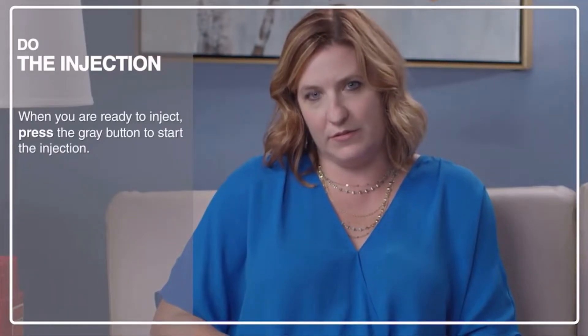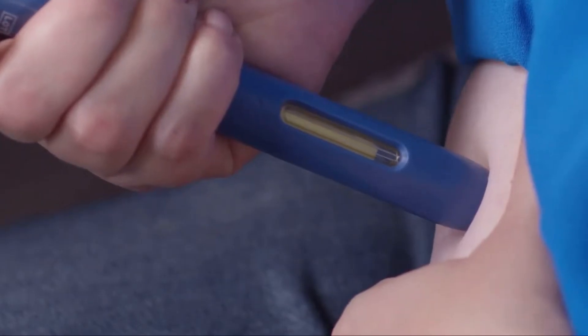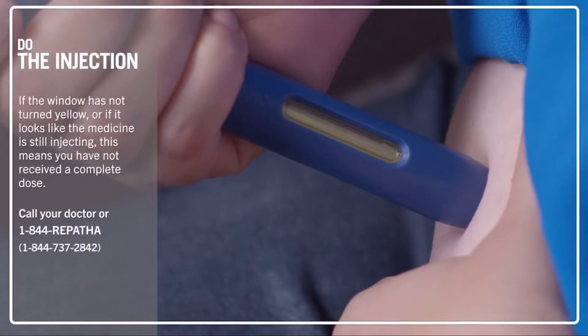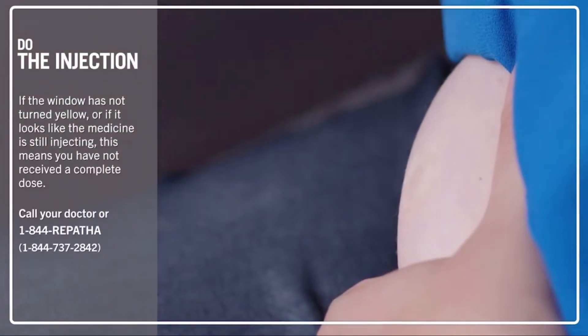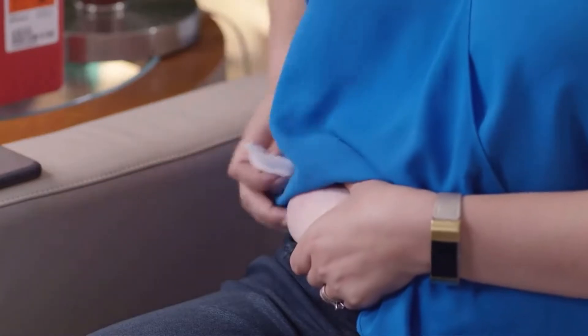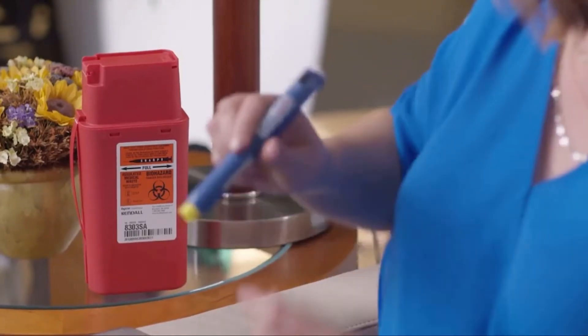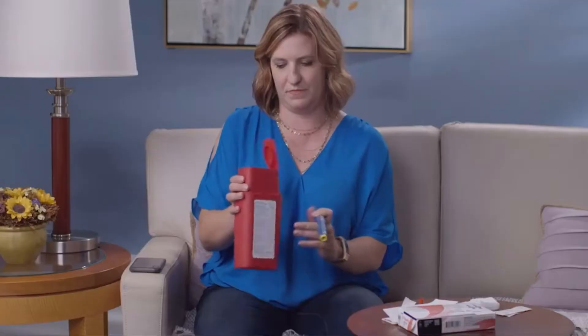When you're ready, press the gray button. You're going to hear a click. You may hear a second click, or you can count to 15, but the best way to know that the injection is complete is to watch the yellow window. Once the window is completely yellow, you can remove the auto-injector from your skin. If you see a drop of blood, you can use the gauze or a cotton ball — press it on your skin. You can use a bandage if you want. Then it's time to discard the auto-injector. Place it in the sharps container along with the orange cap. And that's it — you're all done.